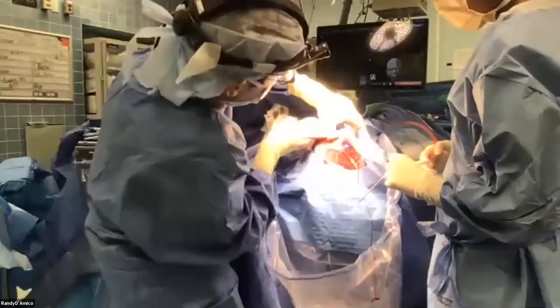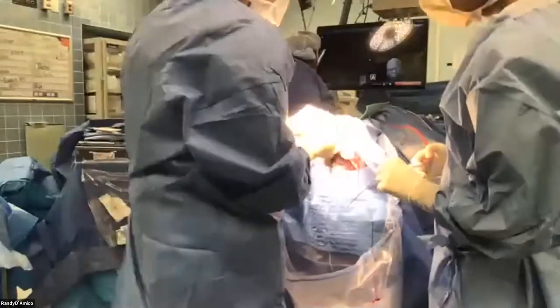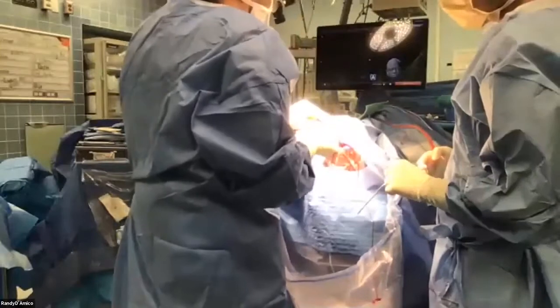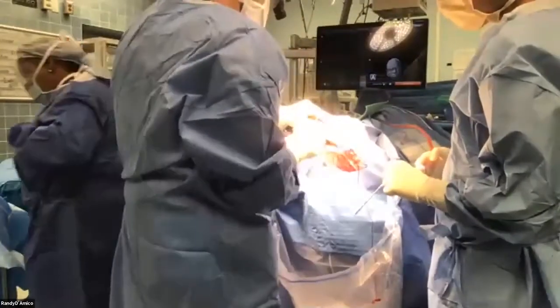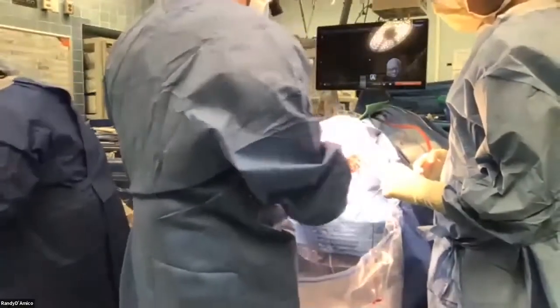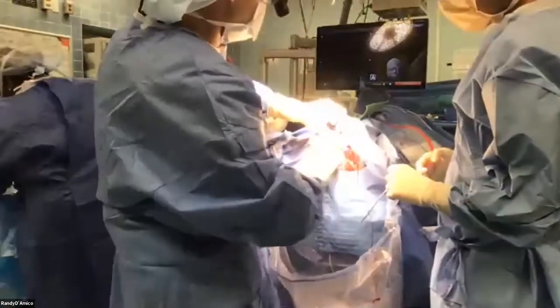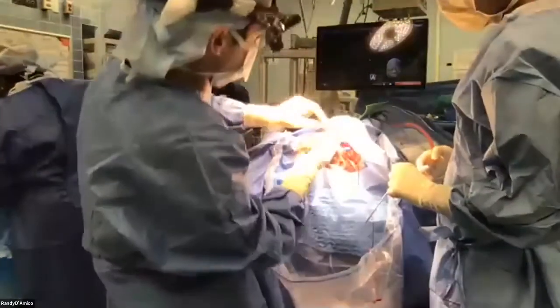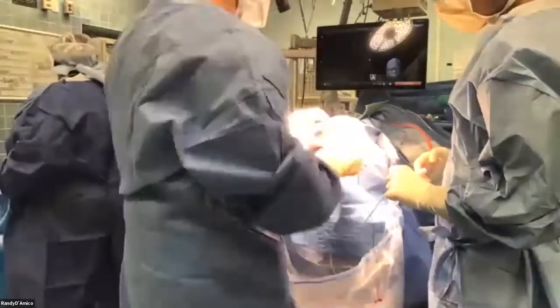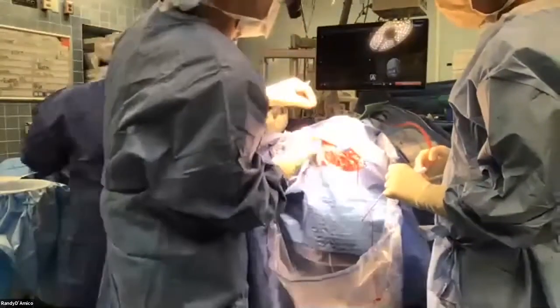Yeah, okay, so see that? That's the pericranium. It's a periosteal fascia that covers all bones. And it's nice to use because it's a vascularized piece of tissue that you can put on top of dura or any other defect that we create, which helps to heal and prevent complications. All right, can I get those Raney clips again? I'm sorry, I knocked them all off.